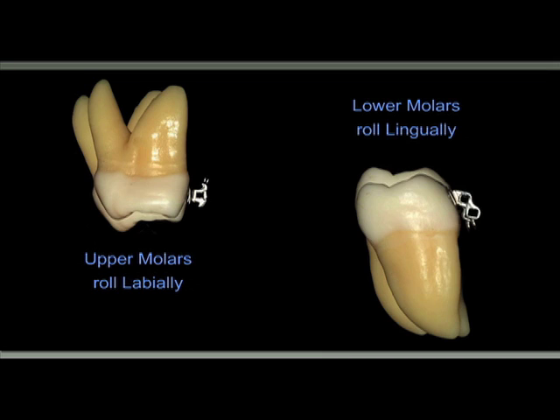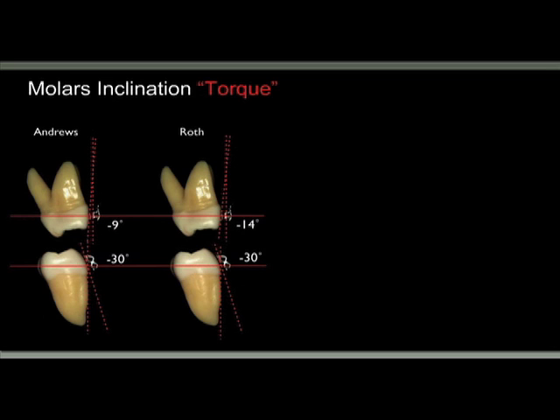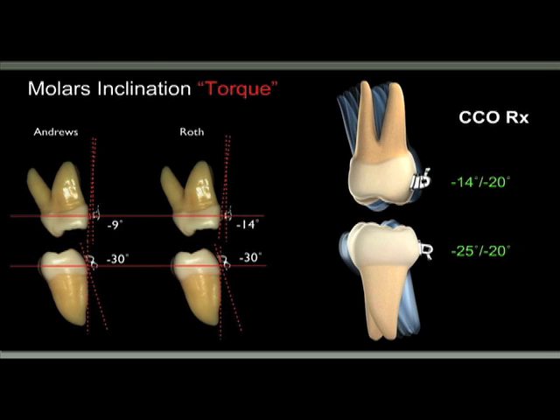The same thing in the upper molars, and usually that palatal cusp is always hanging down, and it's very difficult to level the curve of Wilson, and therefore we need to express more torque on those tubes. As you can see over here, they have changed the prescriptions over the years just to account for that, from Andrews' minus 9 degrees of palatal torque for the molars, Roth overcorrected that to minus 14 to try to level the curve of Wilson for functional reasons, and it wasn't enough, and we modified that with the CCO prescription, and we have a molar tube of minus 14 and one with minus 20 specifically for the second molars, as well as the lowers.